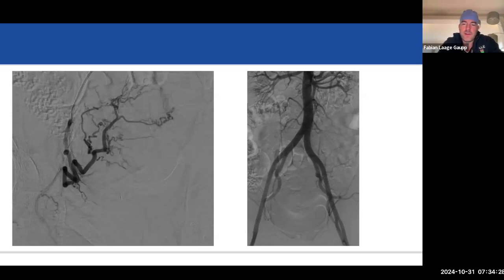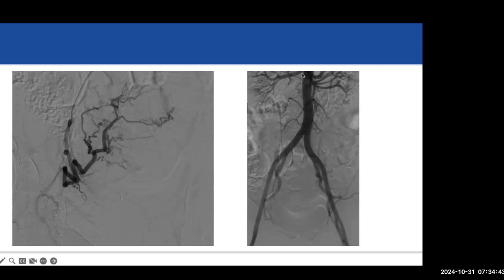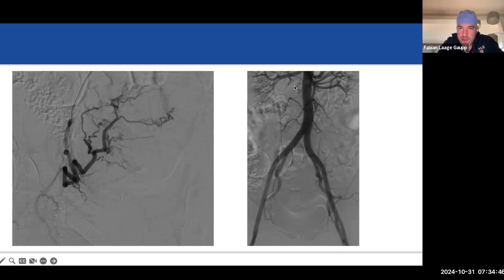Basically, you're looking if there's any other supply to the uterus. So you can see now we're doing the aortogram here. We no longer see the uterine arteries. The uterine arteries are already shut down, but we're looking if there's any ovarian supply. The ovarian arteries come off the aorta here, and they look really squiggly. They look kind of similar to the uterine artery here, just usually even smaller, with these very tight turns. So they're relatively easy to recognize once you've seen one.